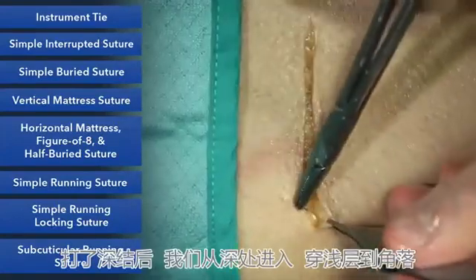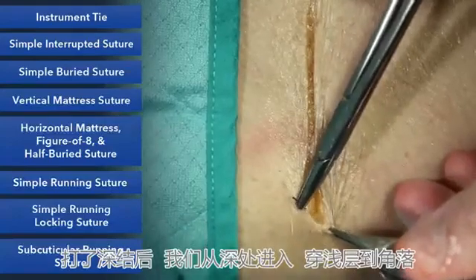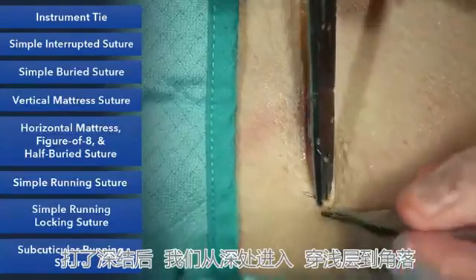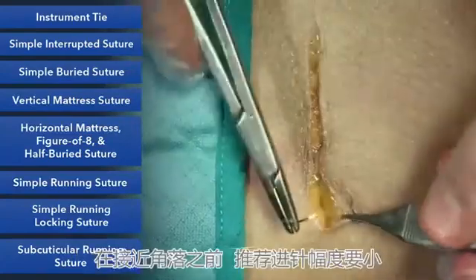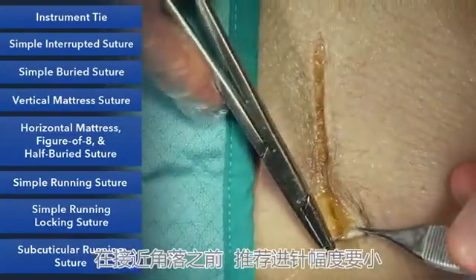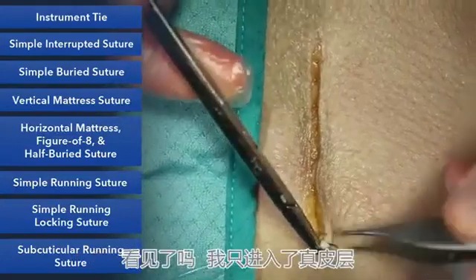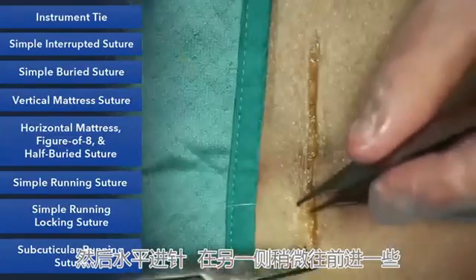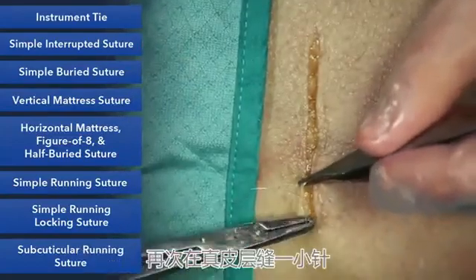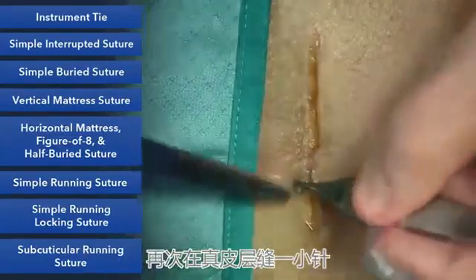Now the knot is deep, so we're going to go deep and then come superficial, and that brings us right up to the corner. And this is where we're going to start our subcuticular run. When you start or get close to a corner, I definitely recommend smaller bites to start. See, I'm just within the dermis, a horizontal bite. We'll need to advance a little bit on the other side and take another small bite. Again, stay well within the dermis.